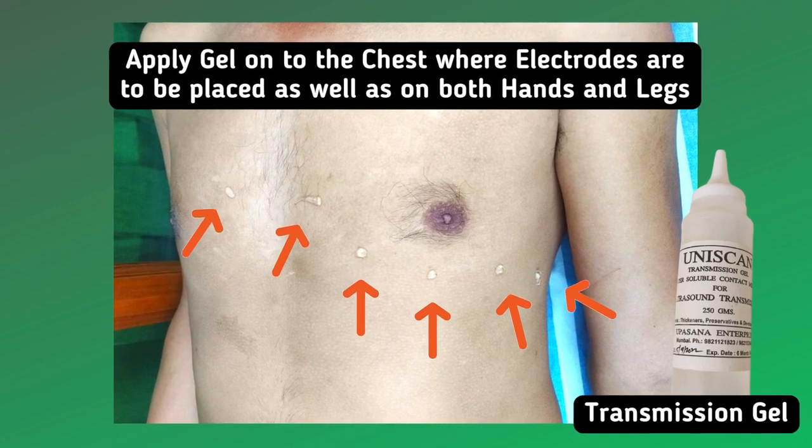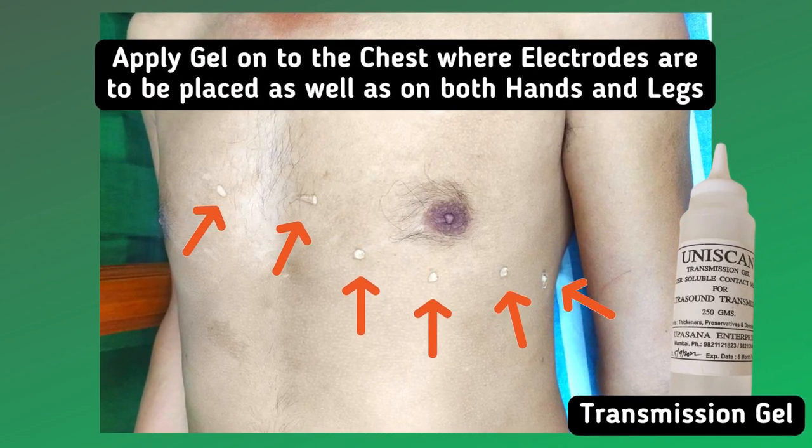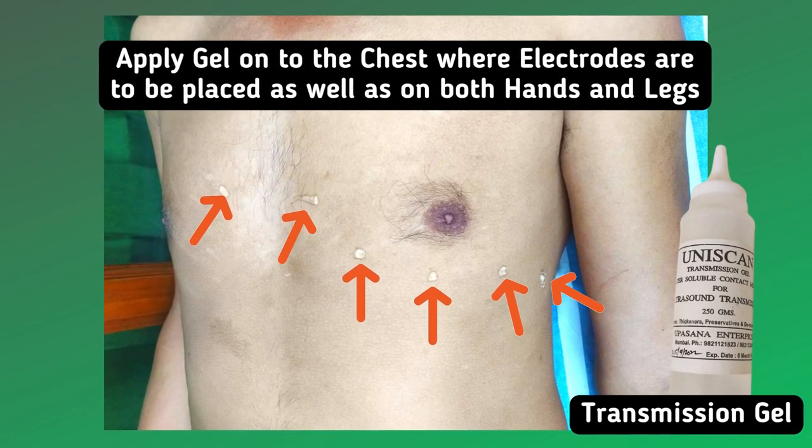Apply transmission gel onto the chest where electrodes are to be placed, as well as on both hands and legs.